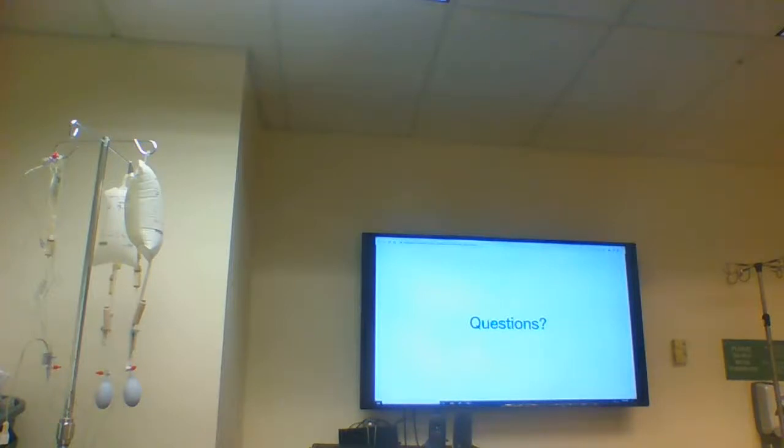She's going home today. I mean, that day. And then I placed the board even a little bit higher to get rid of the edema up here, and the arm looks more even. And that's how she went home. I thought that we can't do anything about the edema because the hematoma is occluding the venous return, so everything's just kind of third spacing from there.